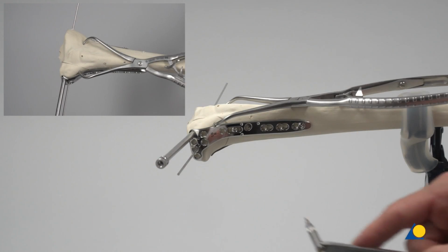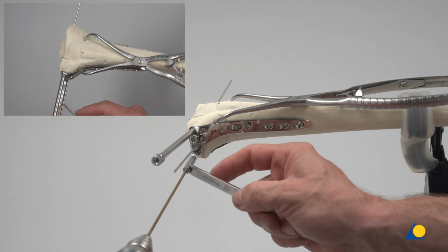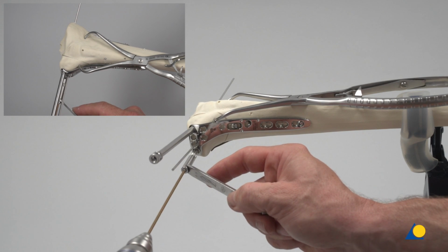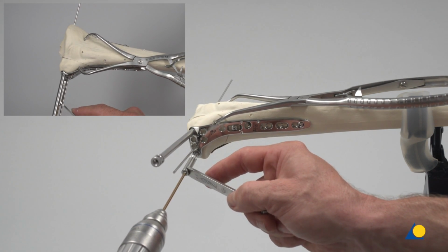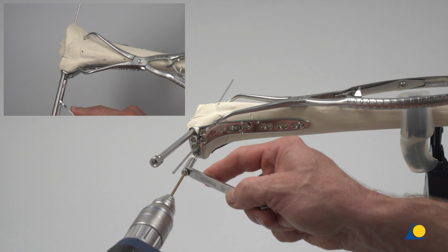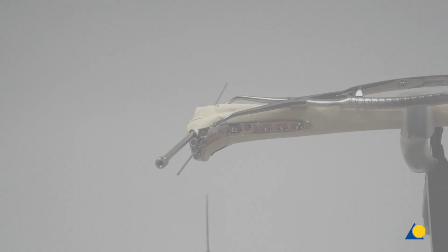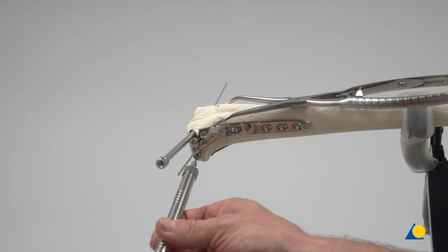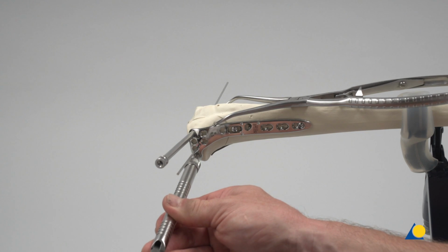In this exercise, the plate-to-bone compression is performed proximally with a compression screw. Note that these rarely require over-drilling. Alternatively, a large periarticular clamp can be used. Both the screw and clamp compress the plate down to the bone and potentially assist in narrowing the fracture gap. If a screw is used, the screw insertion steps for a 3.5 mm cortex screw are repeated.